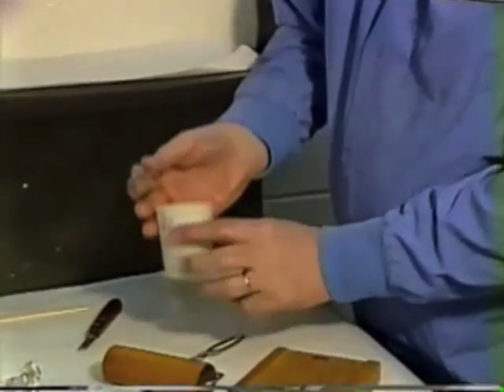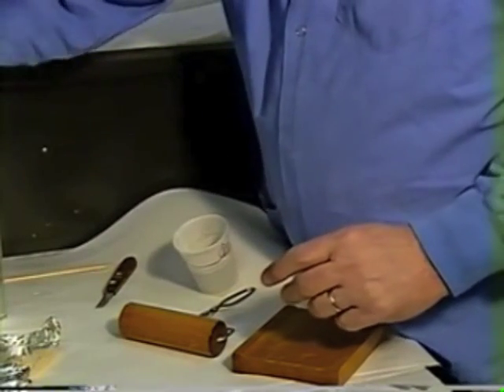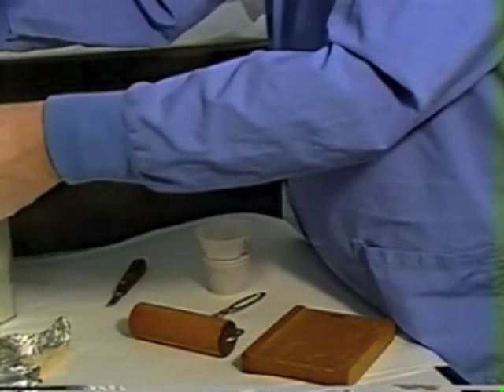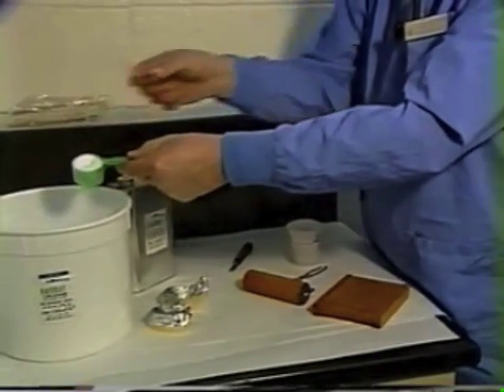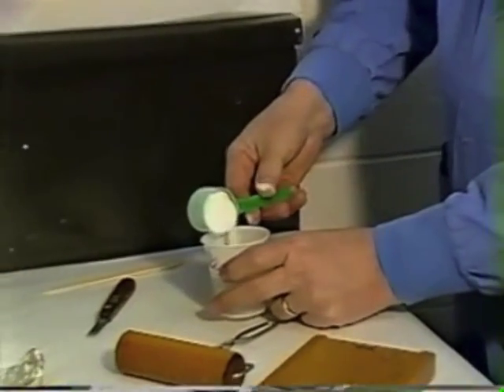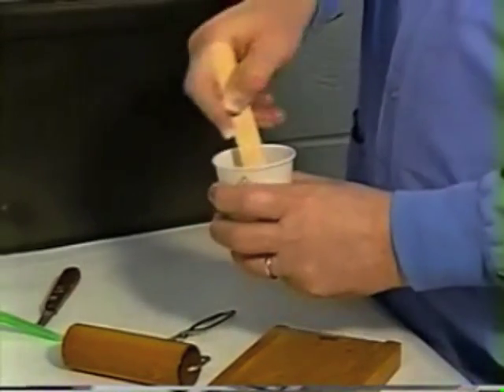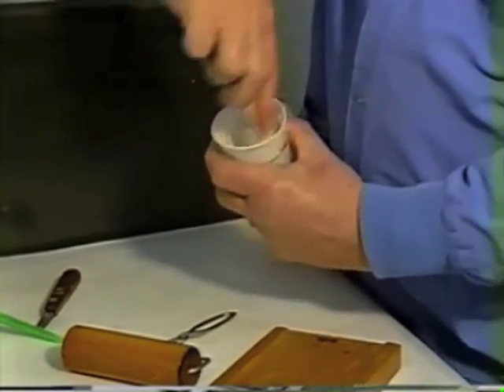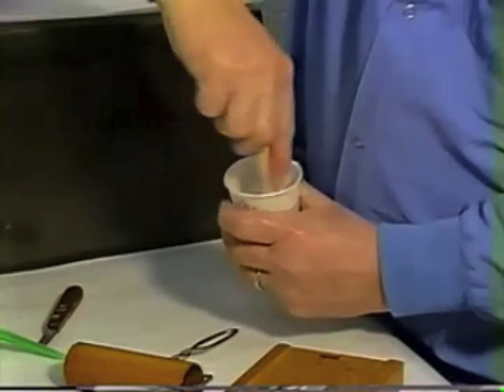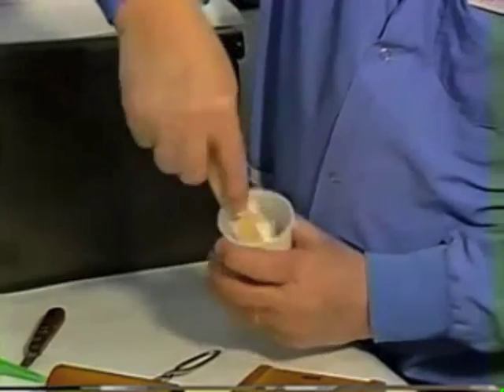Measure one full measure of the monomer into a waxed paper cup — make sure it is a waxed paper cup and not a plastic cup. Then measure one scoop of the polymer and take a little extra out so that it is not quite full, so we'll end up with a mix we can work with. Dump the polymer into the monomer and mix the material until all of the polymer is thoroughly wet and there's no dry powder left. It usually takes about 30 seconds to really get that material well mixed.